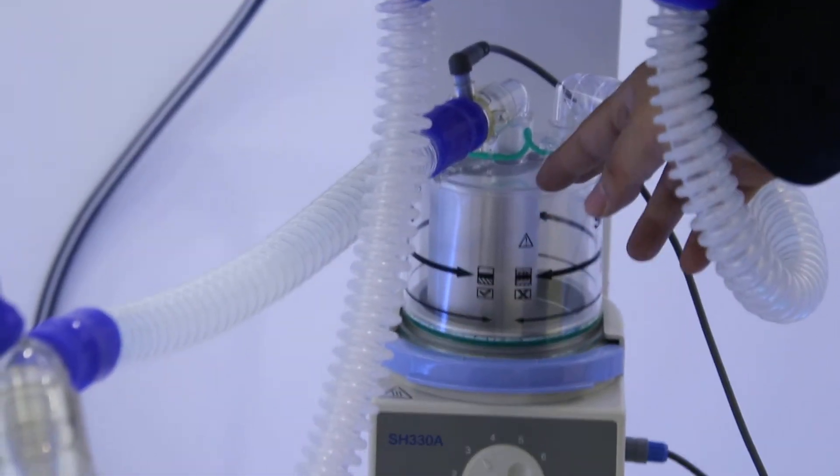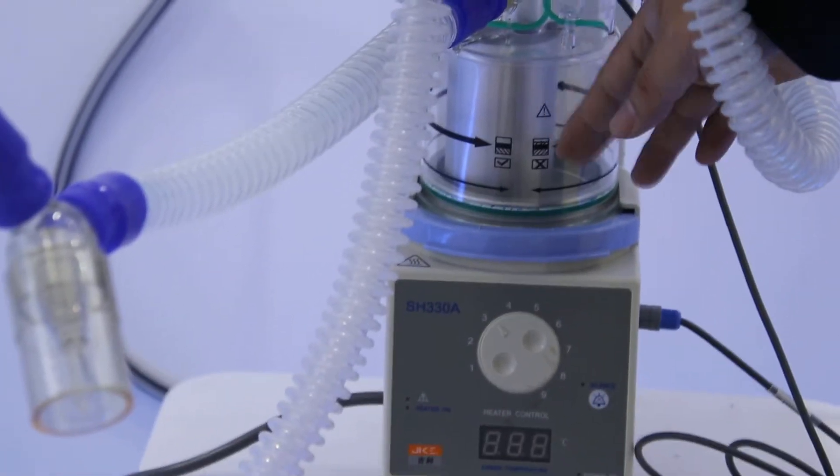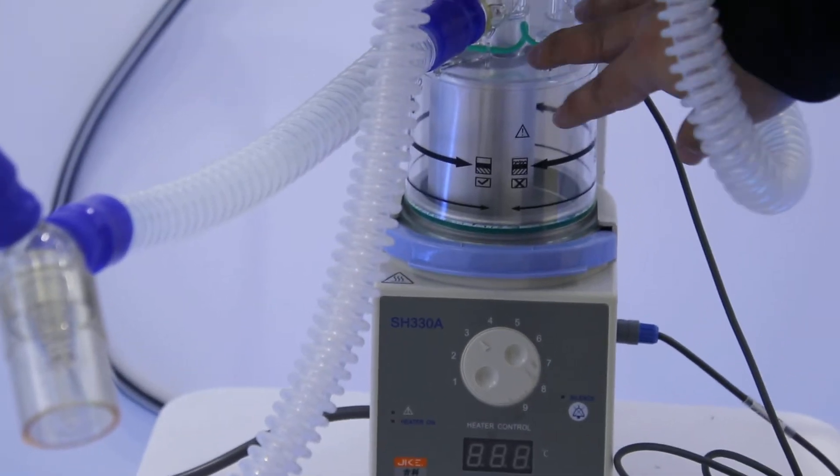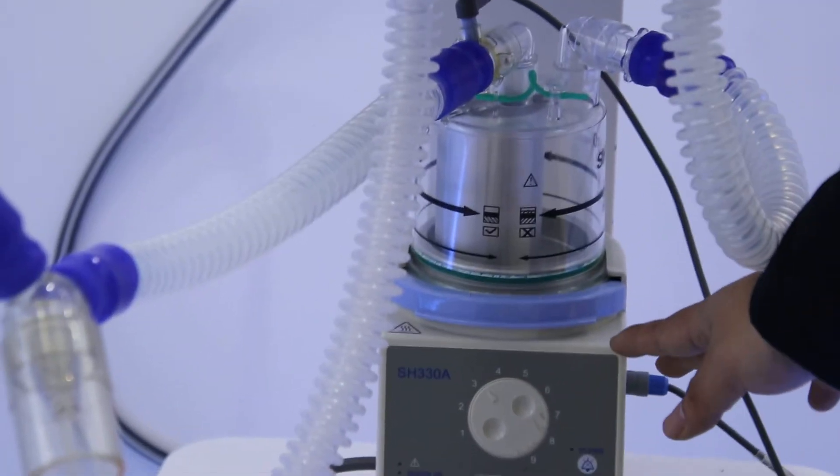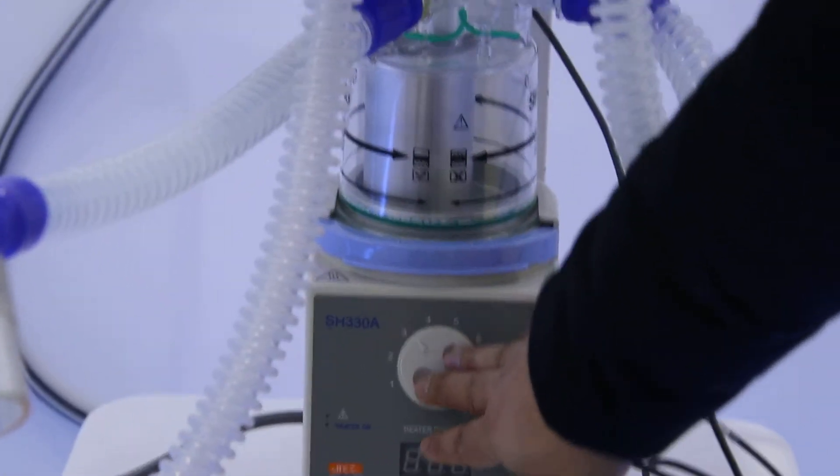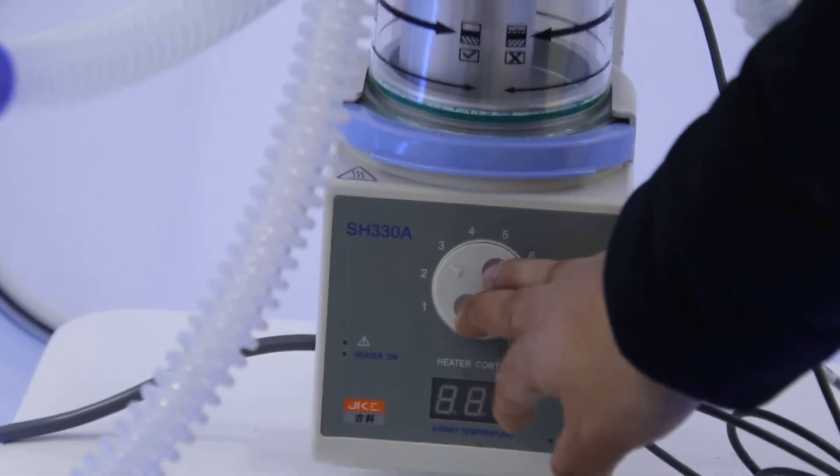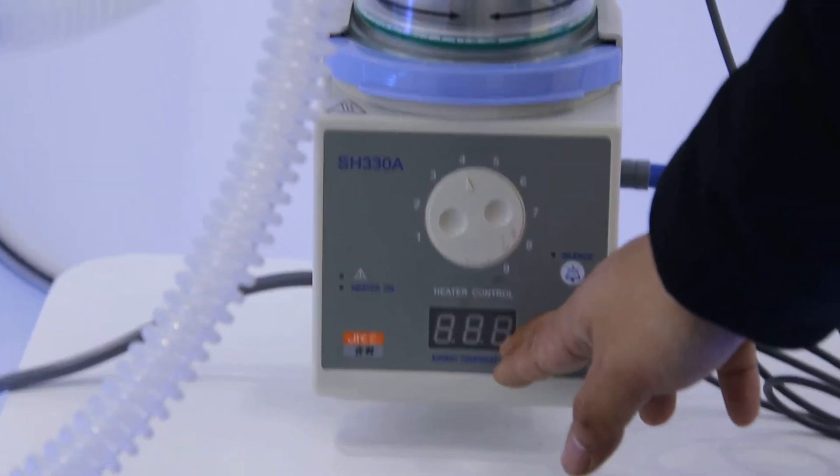And this one is the humidifier. For the humidifier, we have totally three types. And this one is the digital one. You can see here is the water trap and this one is the foundation. And we can use our finger very easily to change the temperature to different levels. And the temperature will be shown here in real time.